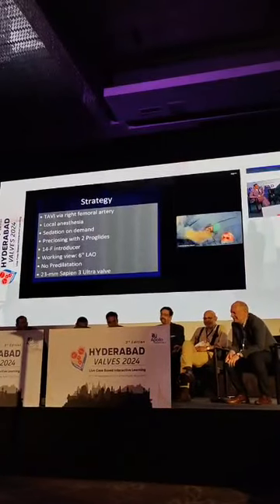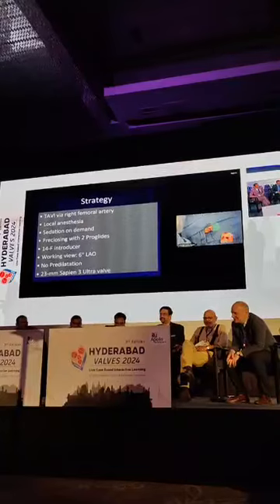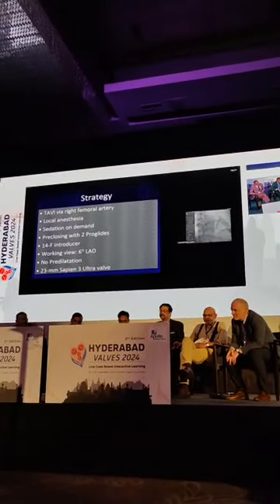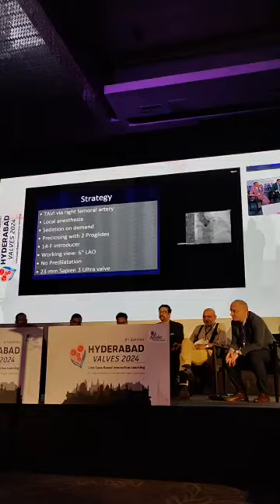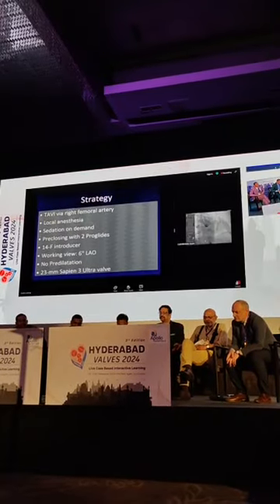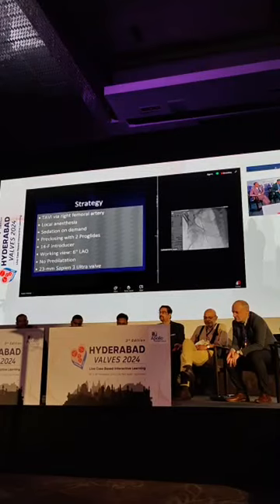So maybe we'll show you the angio first, just to show you the aortogram. You will see on the screen that the valve is calcified, the sinuses are not narrow, the distance is high, and we'll show you where the puncture site was done.